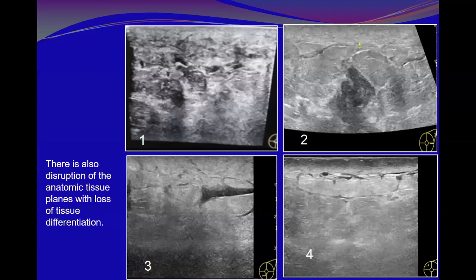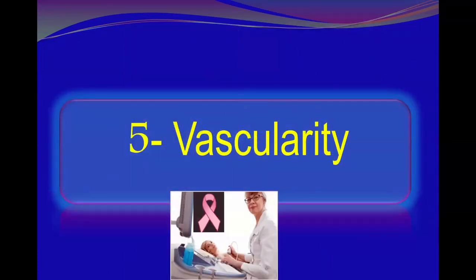Four more cases. Here, this is the malignancy. Look for the diffuse edema with lack of differentiation and remarkable skin thickening. And here are hypoechoic infiltrating subareolar lymphatics with the malignant process surrounding them, with diffuse hyperechogenicity due to the swollen edematous breast. Look also at how the skin becomes hyperechoic and edematous, with lack of differentiation between the skin and the subcutaneous tissue. All of the tissue becomes hyperechoic due to extensive breast edema. Okay, that is regarding breast edema.